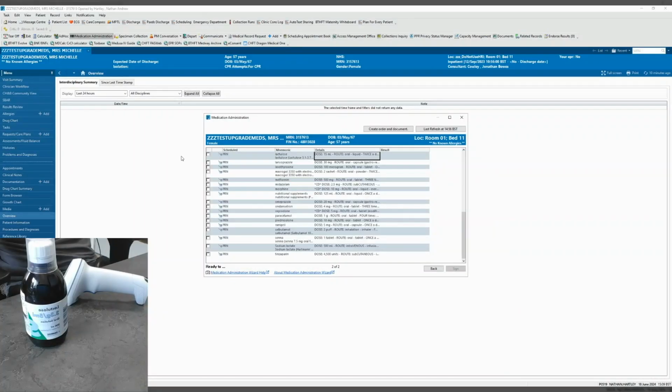In this next tutorial, I'm going to show you how easy it is to underdose scan a drug on order. So in this example, I am using lactulose oral solution 5 ml scanned, but 15 ml prescribed. Please note that we do not currently recommend scanning liquids, but this is what the CLMA process for liquids will be in the future.